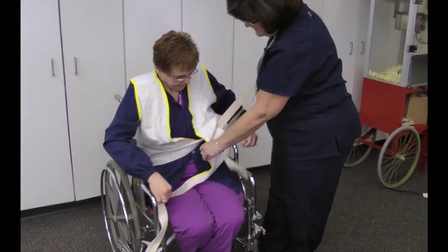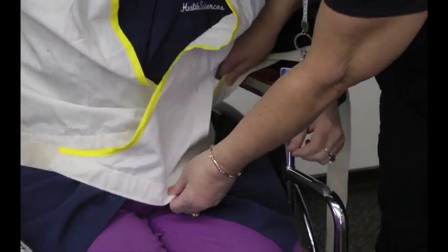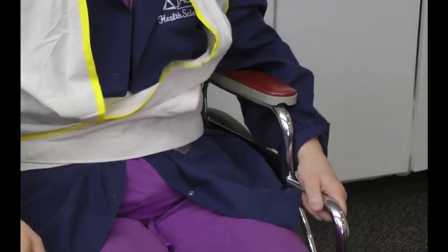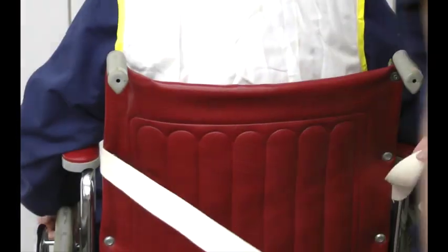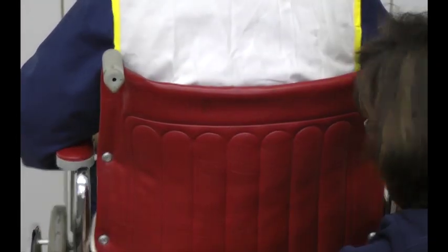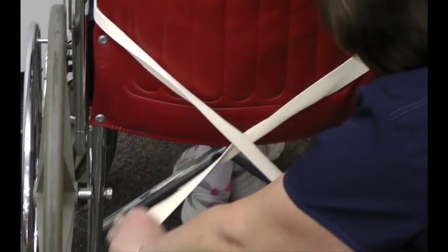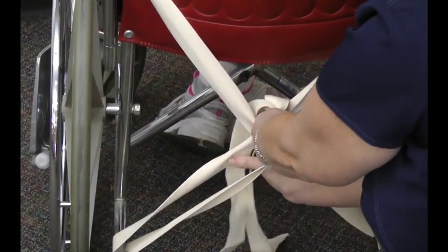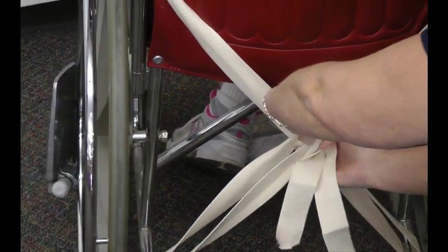And right over the top of this one. Again, I'm going to turn this chair around so you can see how it comes through the back here. It's not too tight, is it, Melissa? No. Okay. I'm going to cross it on the support of the wheelchair, bring it back up again, flip it over, making a slip knot. These strings are a little bit longer, so it's going to be easier to see.